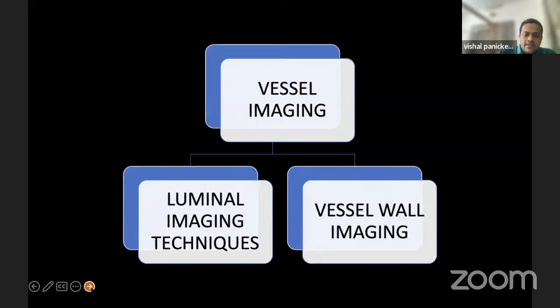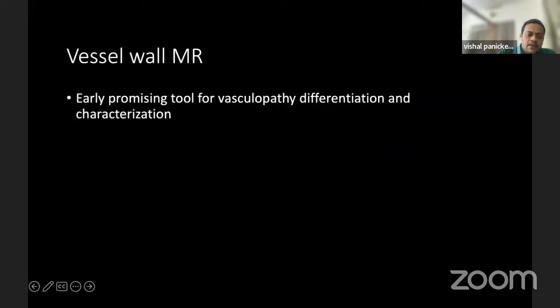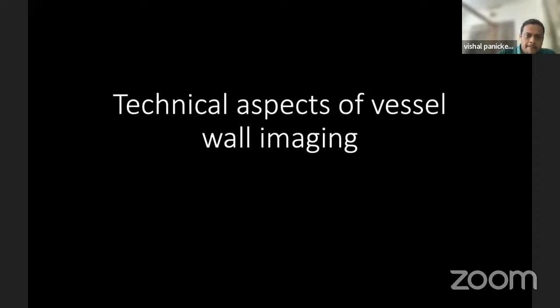When we talk about vessel imaging, conventionally it is luminal imaging techniques like MR angiogram, CT angiogram, and the gold standard DSA. And the newer modality is vessel wall imaging. It is an early promising tool for vasculopathy differentiation and characterization.